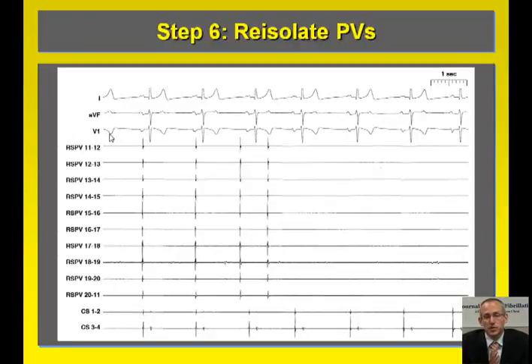This is not the end of the procedure. As I showed to you, there was a PV-LA reconnection in the case that I presented to you, so the final step of the procedure would be to re-isolate all reconnected pulmonary veins in order to eliminate potential triggers for recurrences.